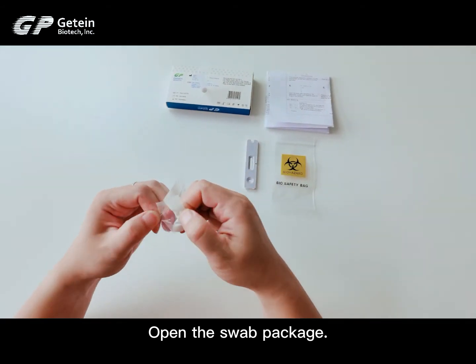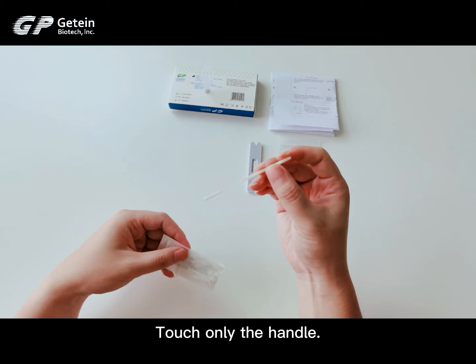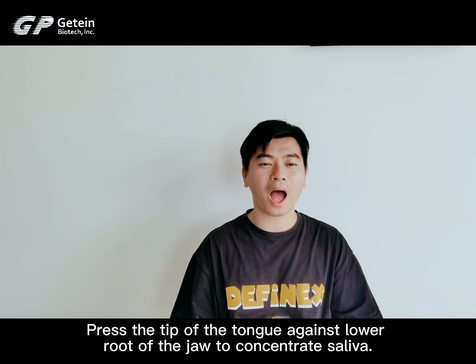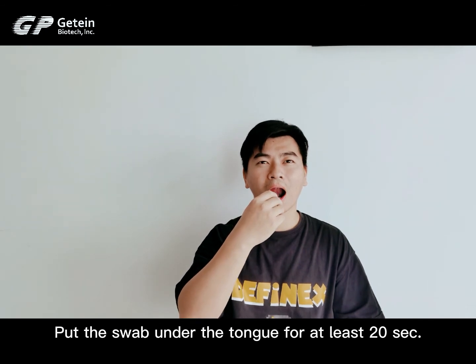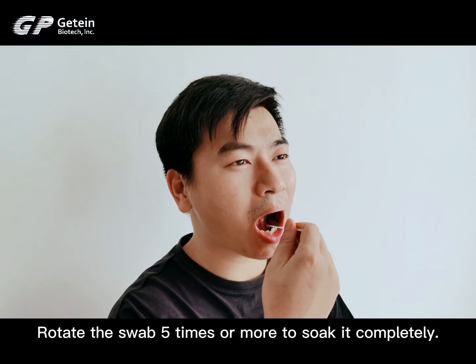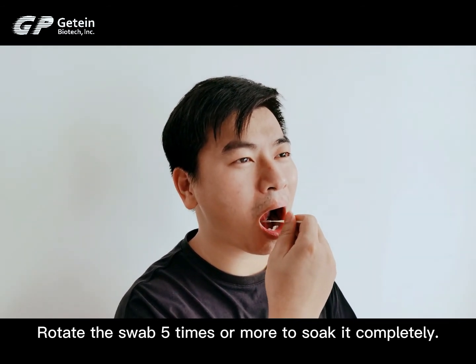Open the swab package. Touch only the handle. Press the tip of the tongue against the lower root of the jaw to concentrate saliva. Put the swab under the tongue for at least 20 seconds.